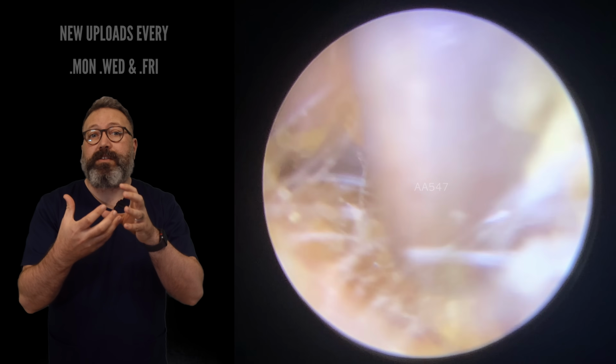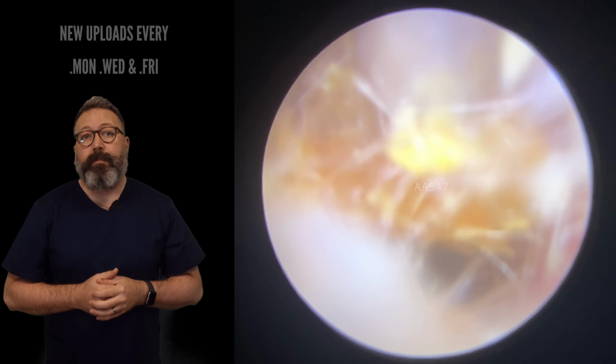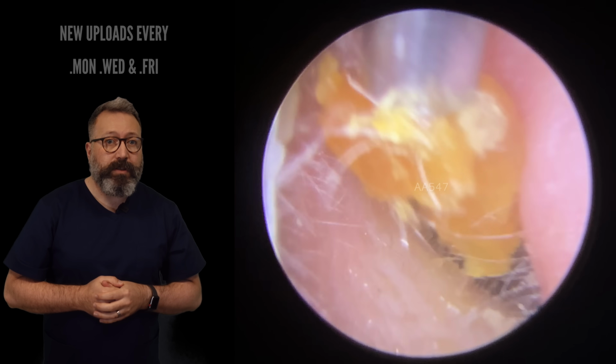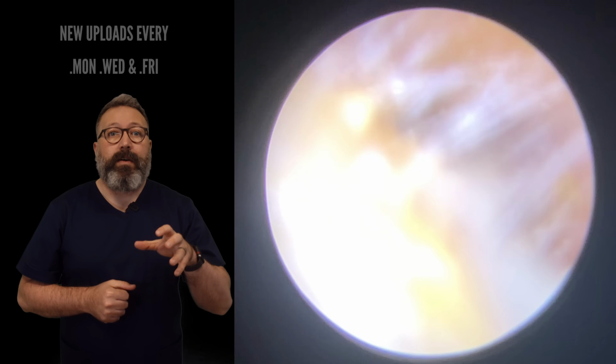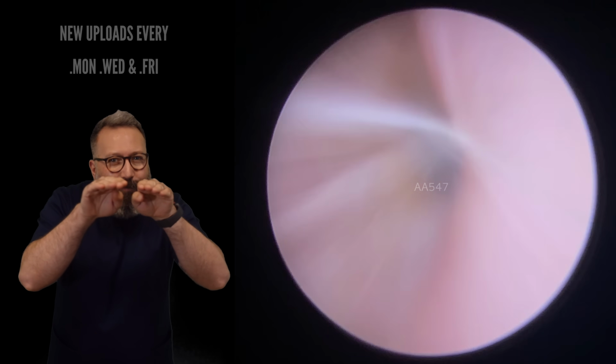So if we get hold of this bit, I think this is going to take the whole chunk out in one go. There we go. Out it starts to come. A good meaty sized piece of wax, that one. Real chunky bit. So we're going to take a look behind that now. There we are. Ooh, you can just see a little ridge.